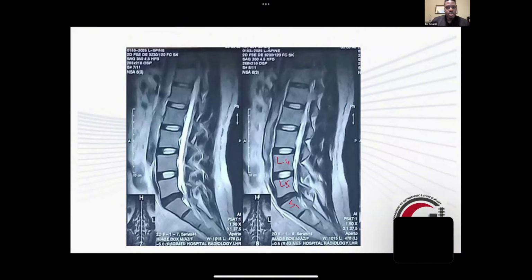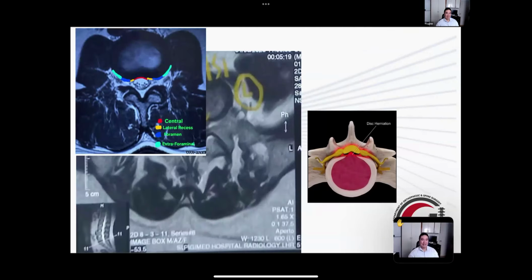Dr. Rafael, do you have a comment? This is a very good question because we are still debating it in the Endoscopic Congress. The L5-S1 foraminal approach is very difficult, and we face a lot of problems. The first is anatomy, because you have the iliac crest. Some people try to angulate a little bit more, and some people bypass the iliac crest by drilling a hole in it.